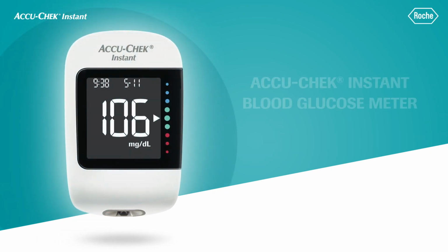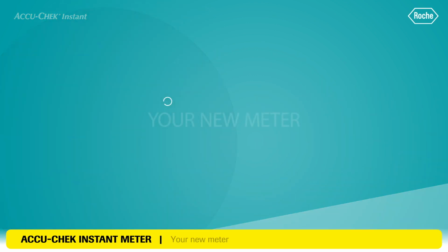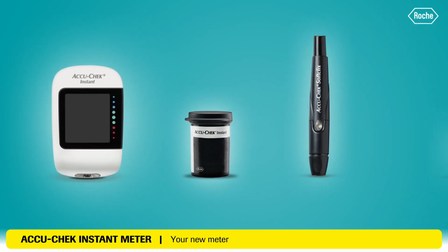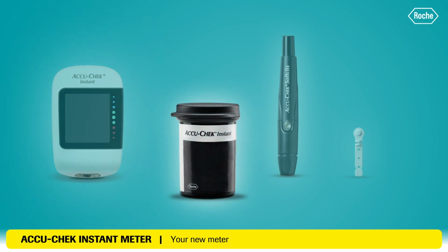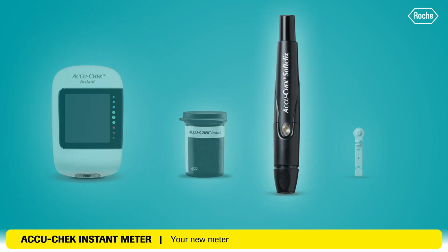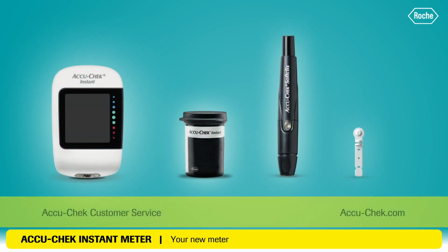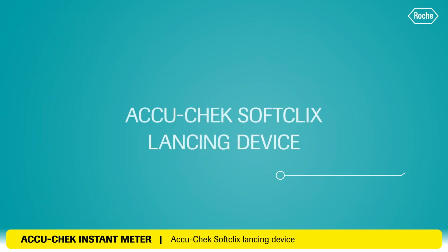In this video, we'll walk you through using your Accu-Chek Instant Blood Glucose Meter. You should have the following items: an Accu-Chek Instant Meter, a container of Accu-Chek Instant Test Strips, an Accu-Chek Softclix lancing device, and an Accu-Chek Softclix lancet. If you can't find something, or if you need assistance with any of the steps that follow, just contact the Accu-Chek customer service. Next, let's walk through setting up and using the Accu-Chek Softclix lancing device.